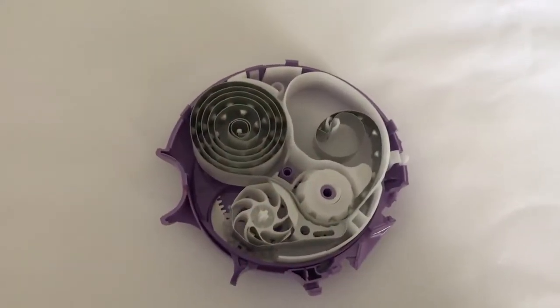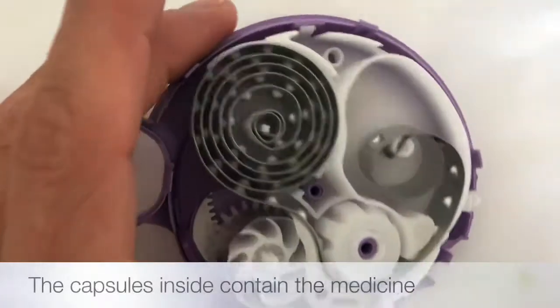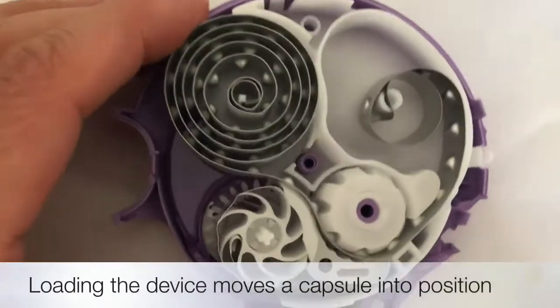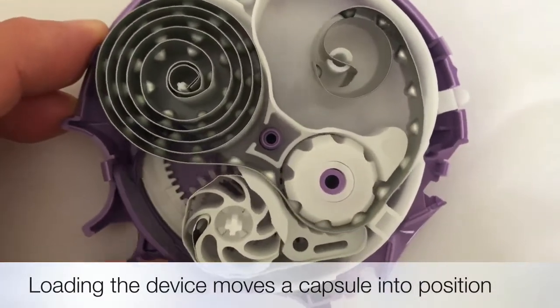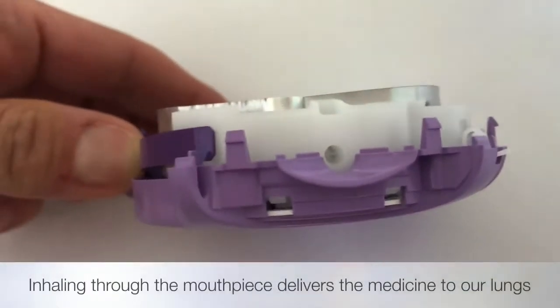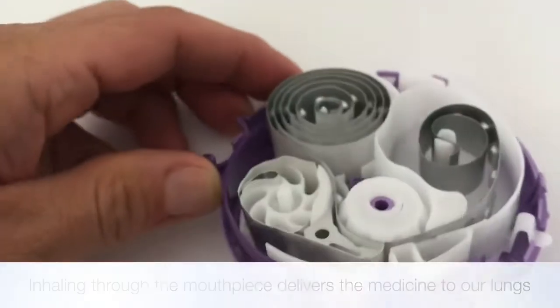I've opened up a purple one here. You can see inside the device there's a bunch of little capsules, and these little capsules contain dry powder — that's the medicine. If we watch carefully, we can see that when we pull down on the sleeve, it moves a capsule into position into the mouthpiece, and then as we breathe in through that mouthpiece, we get the medicine.